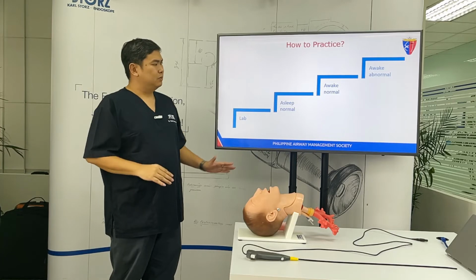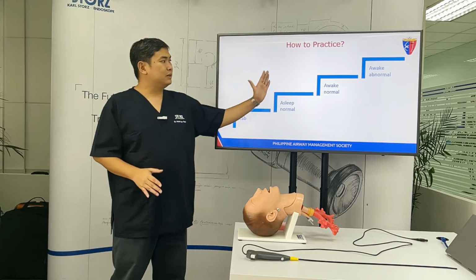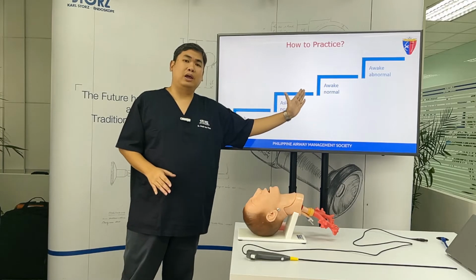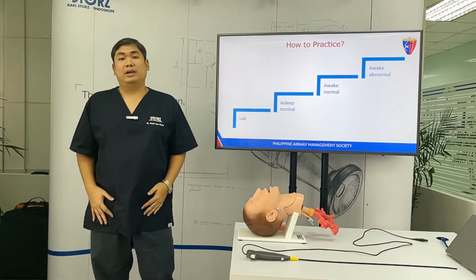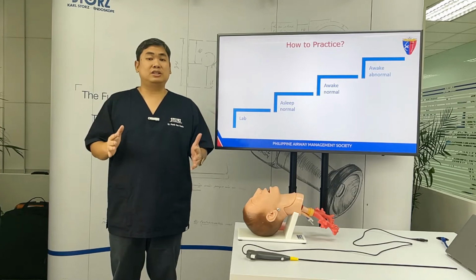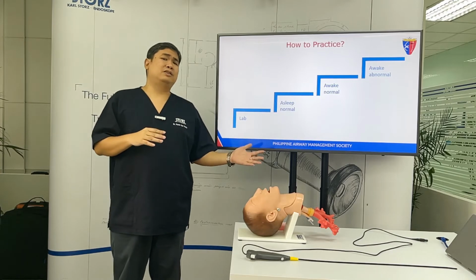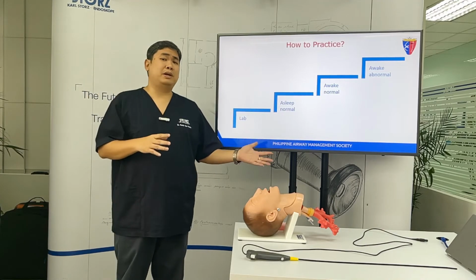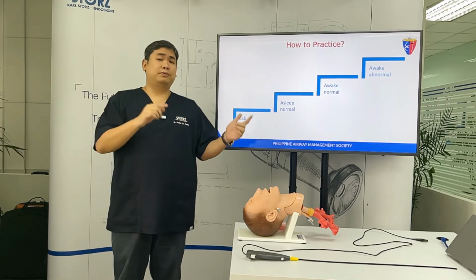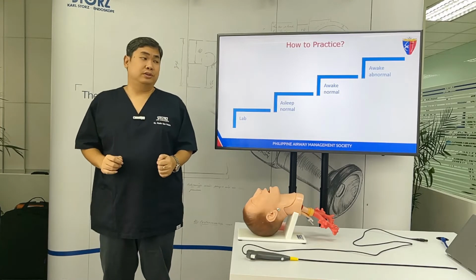After practicing on patients that are asleep with normal airways, you can now practice on patients that are awake with normal airways. So here you could practice your topicalization, anesthesia on the patient. However, this is the challenging part, convincing a patient with normal airway to perform flexible and awake intubation.